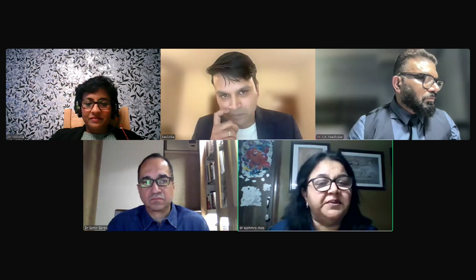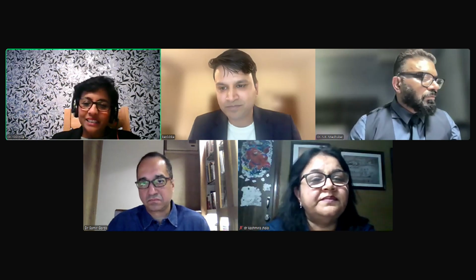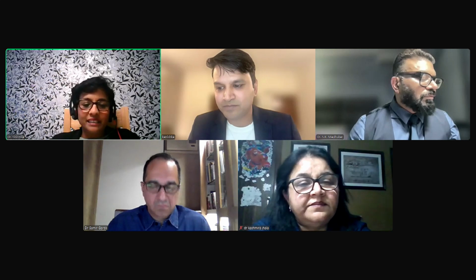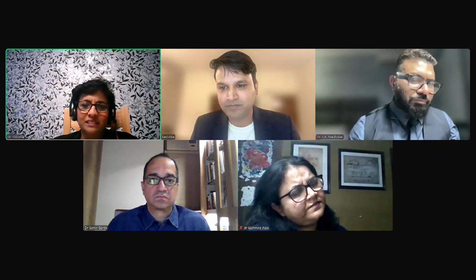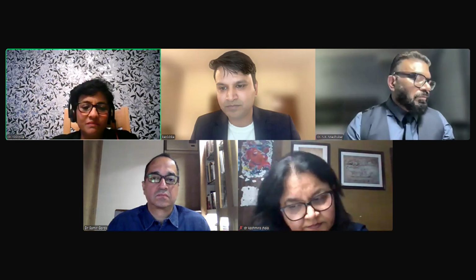To add on this, Dr. Madhukar. Thank you, ma'am. Ma'am, do you want to add something to this? I think between the two of you, you actually answered the question. The mask is equally important as dropping the pressure setting. Generally, I would say the vast majority can be managed between those two options. So you drop the pressure settings, and if that doesn't work, you change the mask.